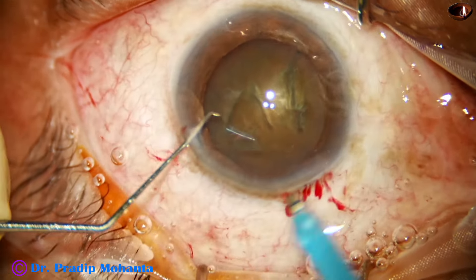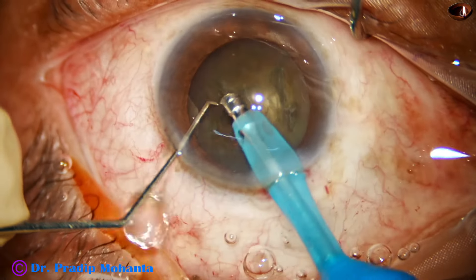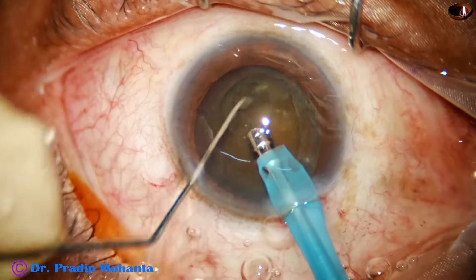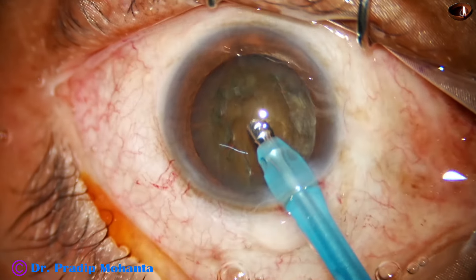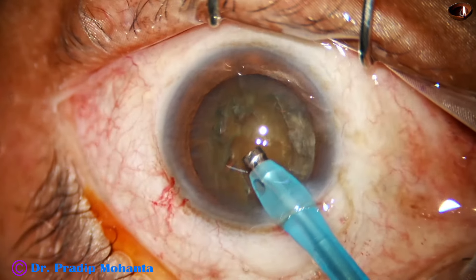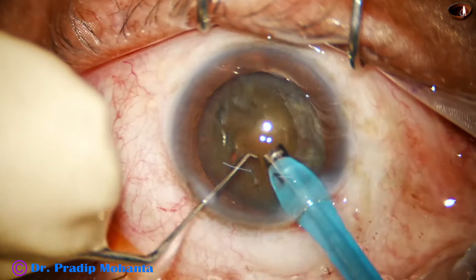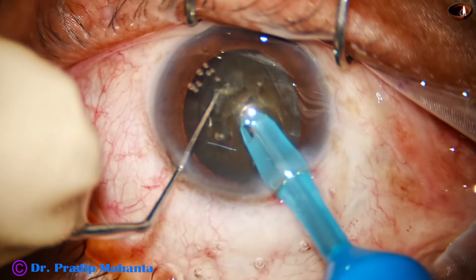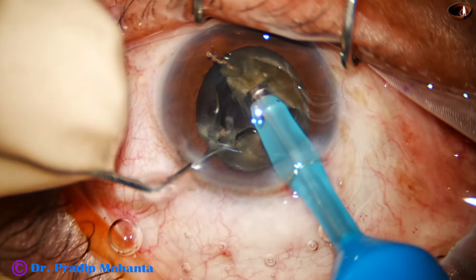Now I'm going to expose the tip a bit more so that I can deliver more ultrasonic energy. Watch my technique: the submarine chop technique. Some superficial cortical lens matter is removed, then the handpiece is turned, the nucleus is rotated, the bevel is turned up — I take help of my left hand to make the bevel up and to keep the irrigation-aspiration tubes straight. Now see the submarine chop technique: the tip is buried completely into the substance of the nucleus, going through the substance as a submarine moves underwater.